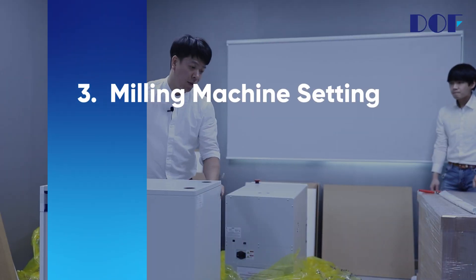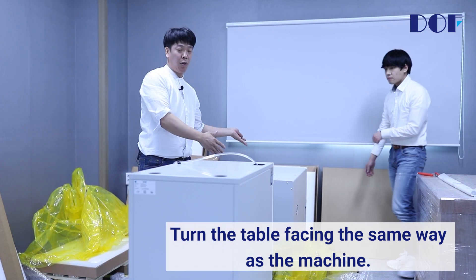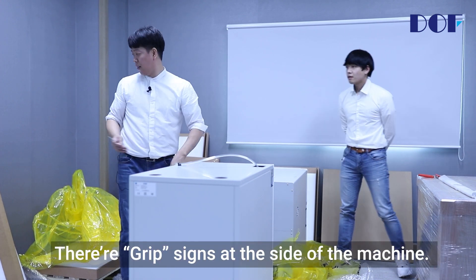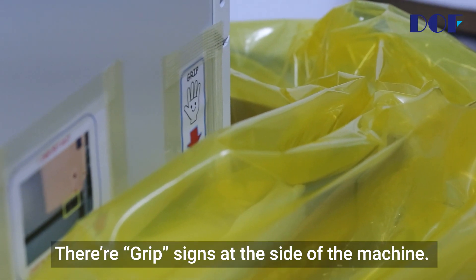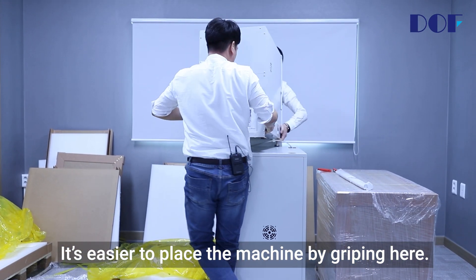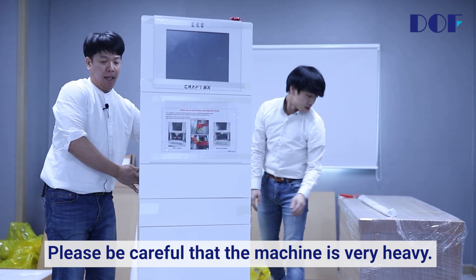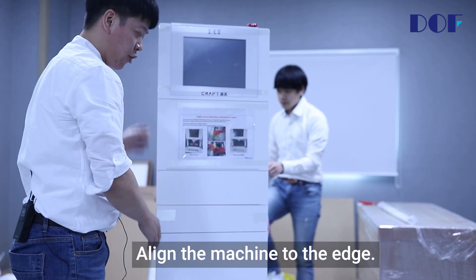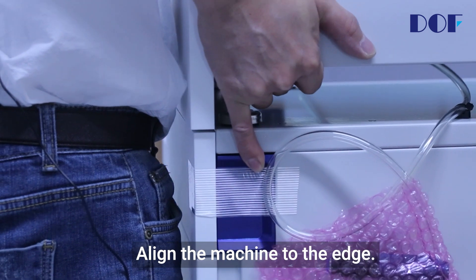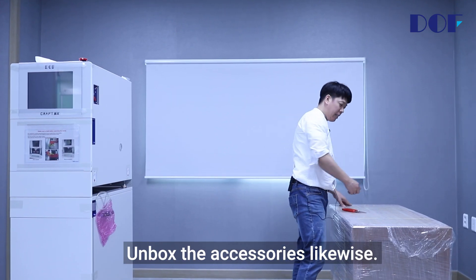Milling machine setting. Turn the table facing the same way as the machine. There are grip signs at the side of the machine — it's easier to place the machine by gripping here. Please be careful that the machine is very heavy. Align the machine to the edge. Unbox the accessories likewise.